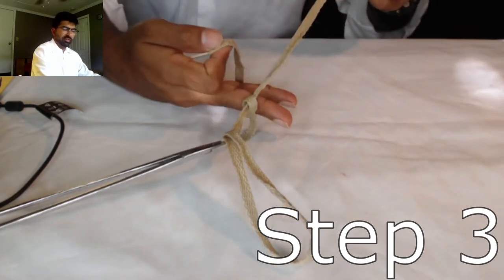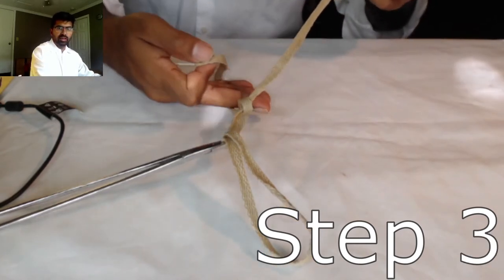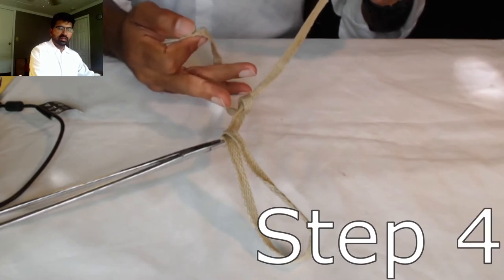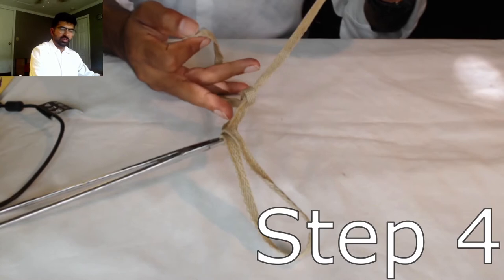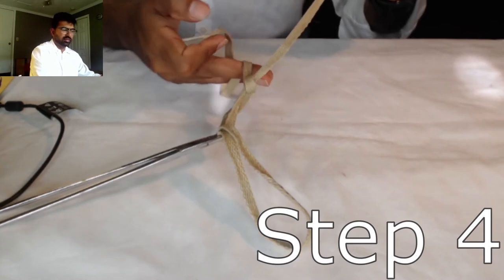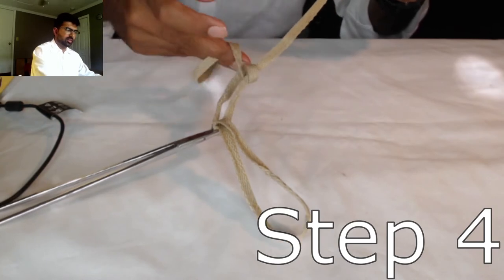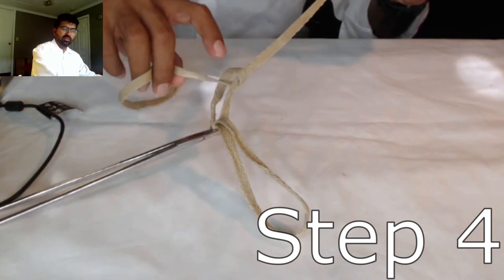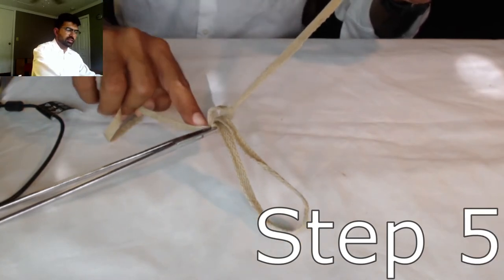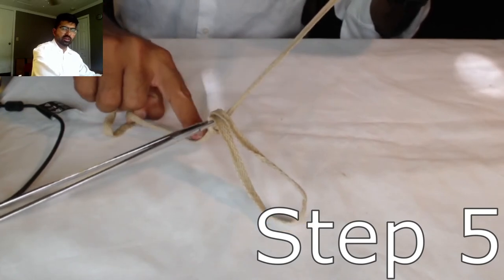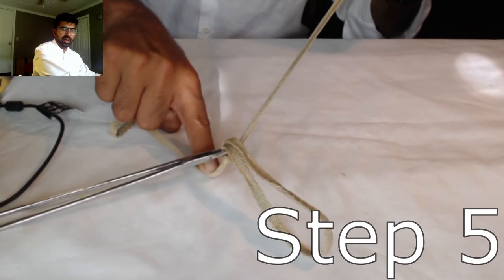Step three, you want to roll that forward. And now what I'm doing here, step four is with my middle finger and my ring finger, I'm just regrabbing that suture, and I can let go with my thumb and my index finger. So what you have here now is you're ready to cinch the knot down. And again, when you cinch it down, you want your index finger below the level of the knot.